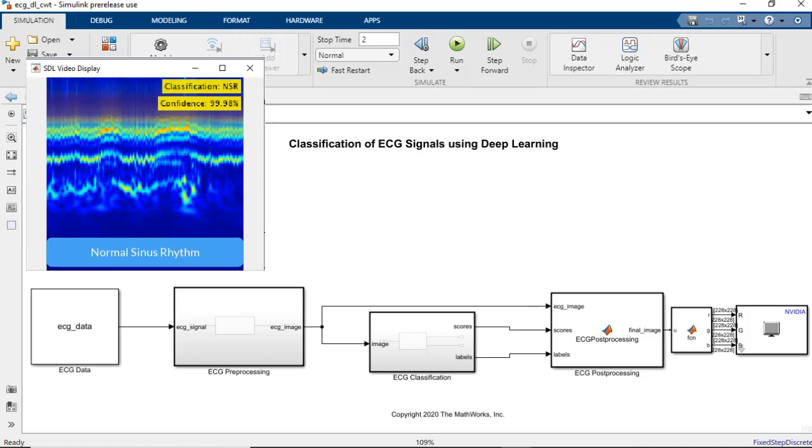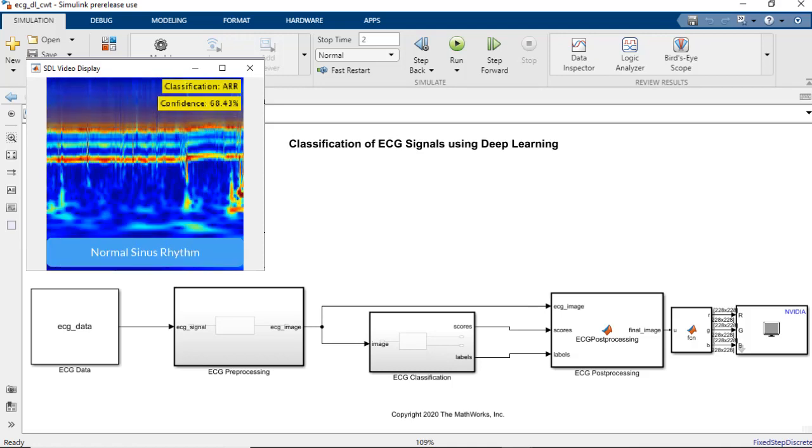In this demo, we use deep learning to classify ECG data to determine if a person is suffering from cardiac arrhythmia or congestive heart failure.